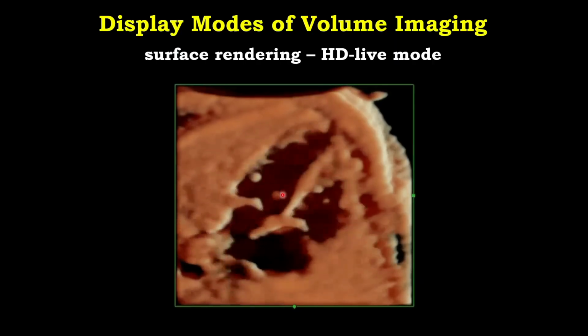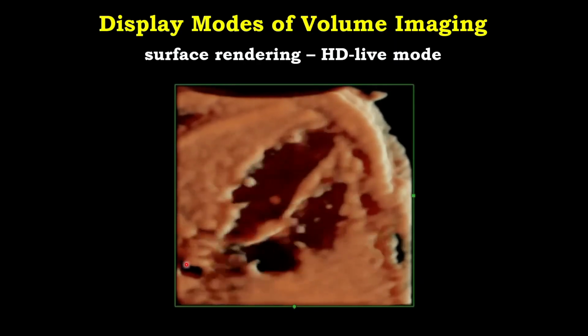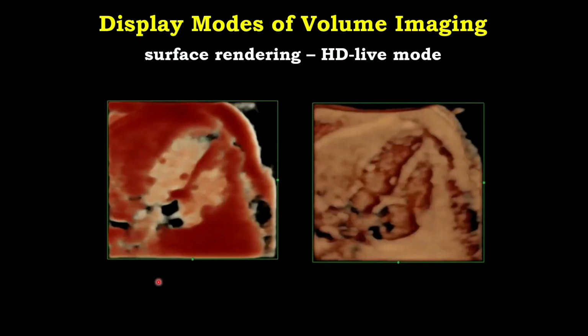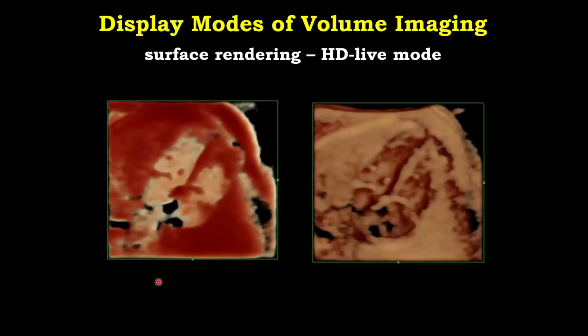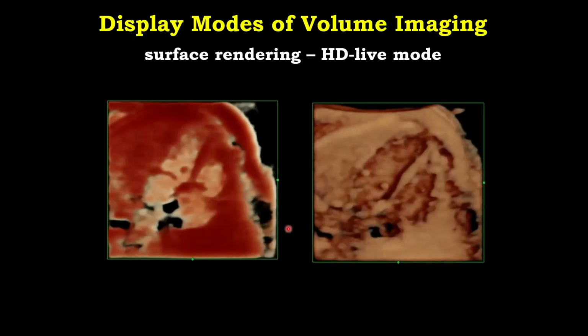So also we can clearly see, for example, these 2 echogenic foci in the left ventricle, and you can look at them and you can see how the image is going to change when we place the source of light behind the image or up front.